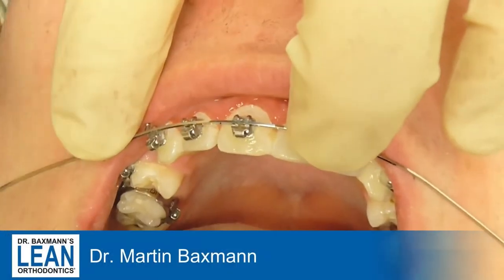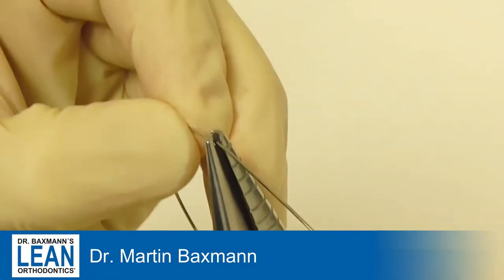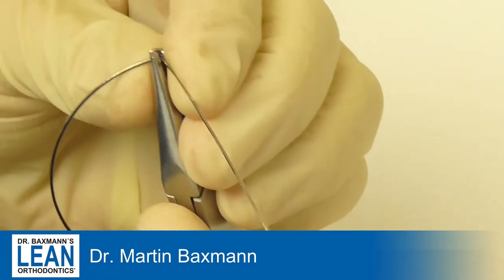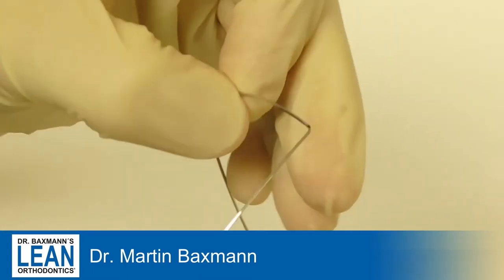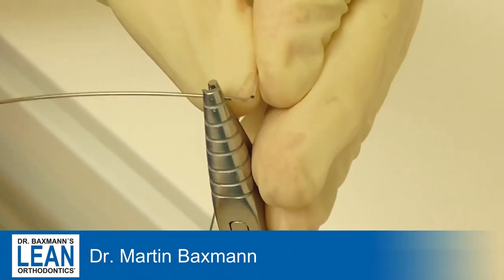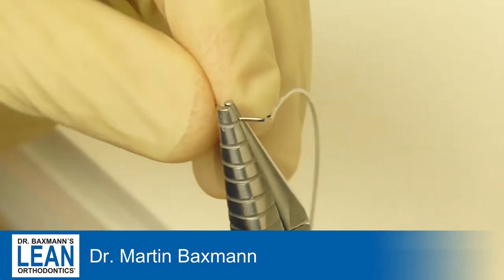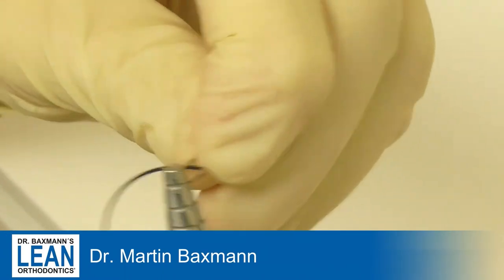As I'm using mainly straight wire appliances, I use loop wires rarely — but I do use them for patients with bad oral hygiene, because there's so much friction that the classic straight wire system sometimes just doesn't work properly. I use a loop bending plier and the 17-25 stainless steel wire in my 22 slot MBT appliance.